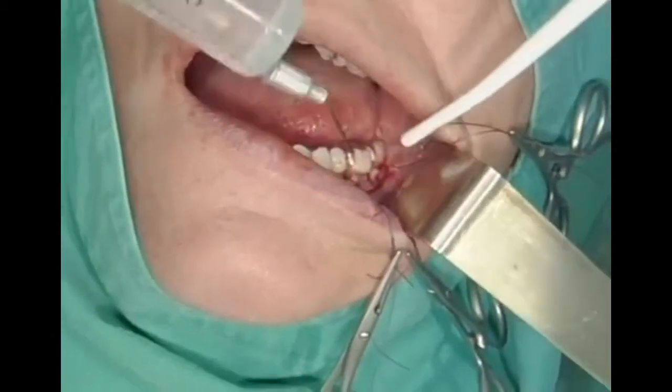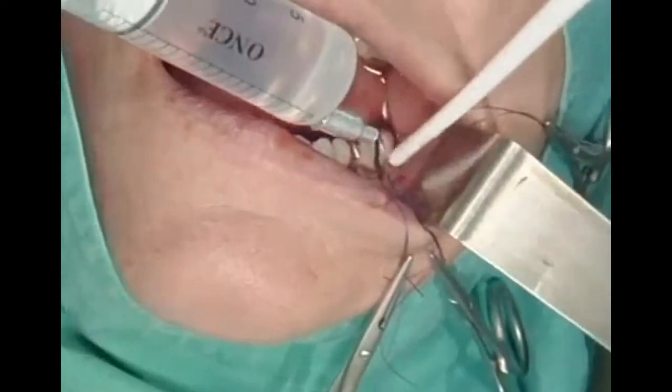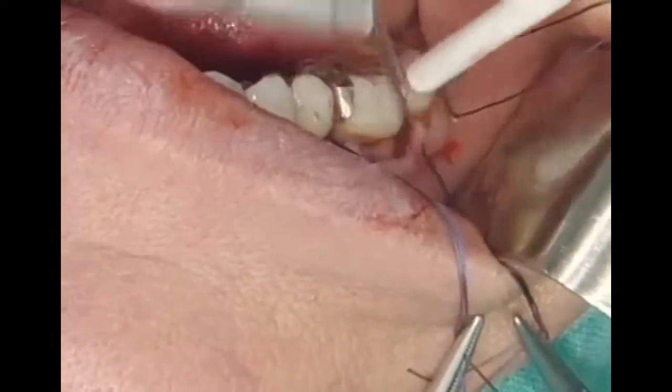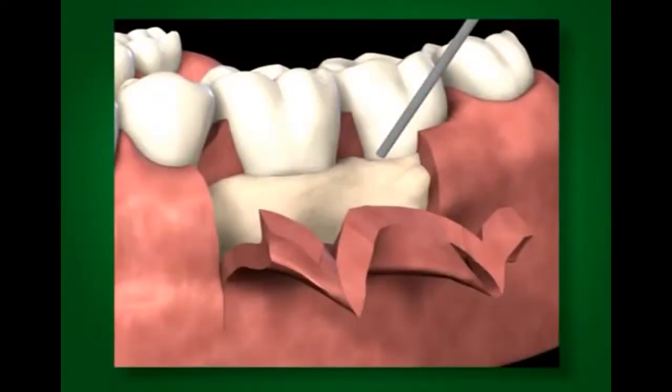After 2 minutes, the site is rinsed again with sterile saline solution. All contact with blood, or especially saliva, on the root surface should be avoided. Less experienced surgeons can perform a larger flap opening, as shown in this graphic. That can help to better protect the root surface from contamination.